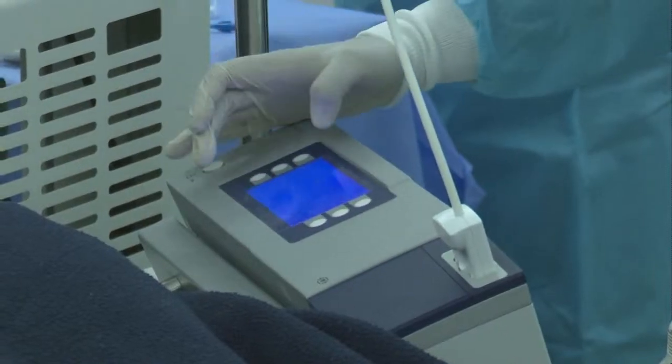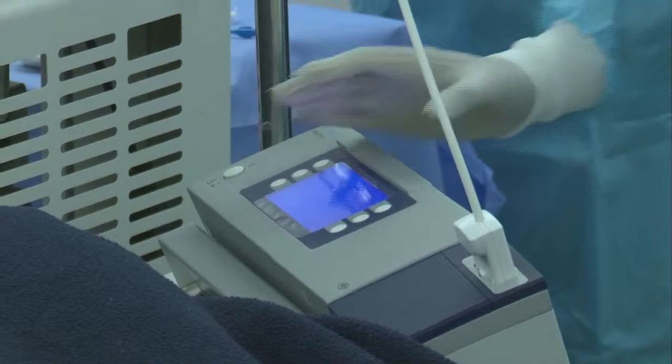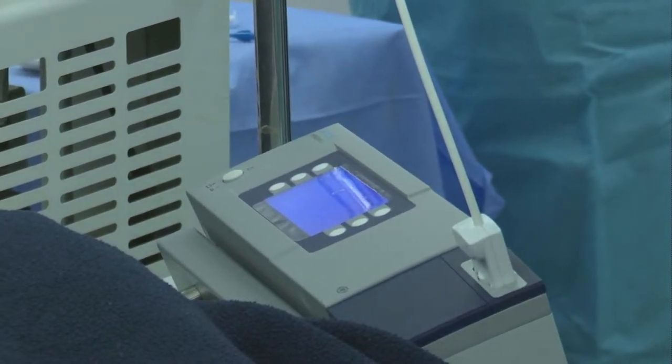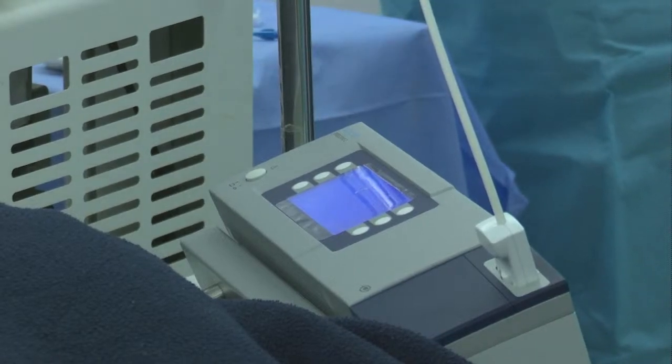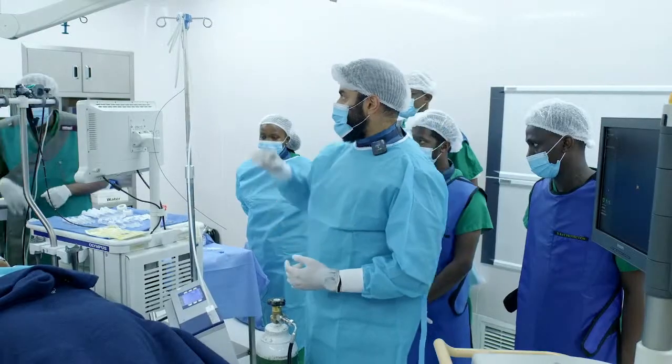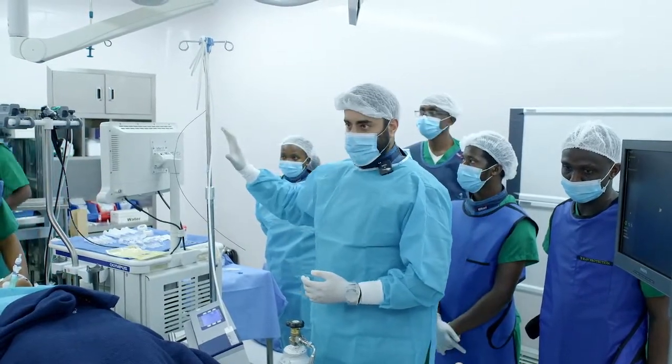And you can program specific settings if you need to. So it's fairly simple. It's controlled by a foot switch next to me there, and the fluoroscopy is controlled by the foot switches that will be next to me as well. The probe is single use, so this is ready for use now.